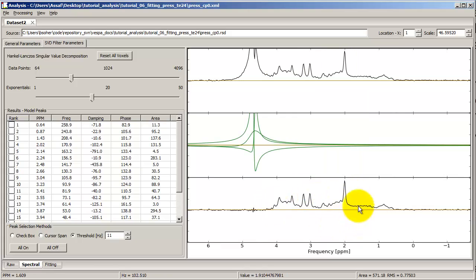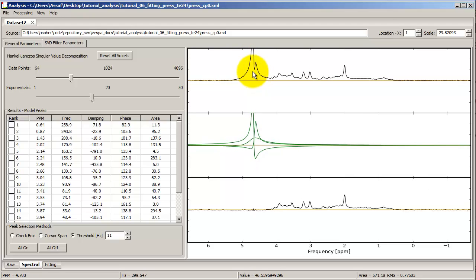Here's my spectrum. So you see the NAA singlet, the creatine, the choline, and water should be at 4.7 ppm. And actually, when we look at the original spectrum, it has a large water peak at about 4.7 ppm. And if I just zoom out vertically a bit, you can see it's not a very nice looking one. It kind of has a bump here. So it's not a really nice Lorentzian ideal water peak, but we'd still like to filter it out. So this SVD filter can be used for that.